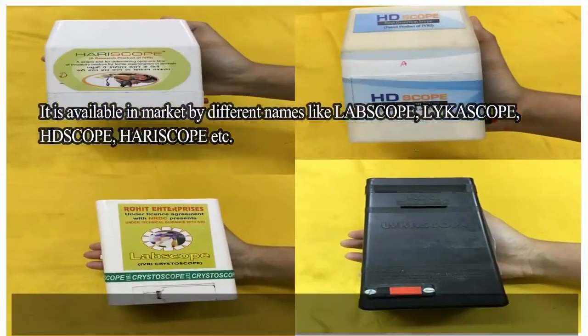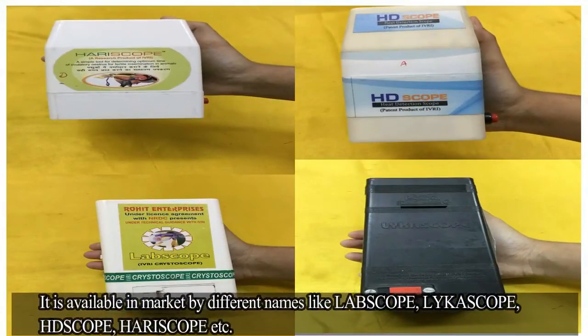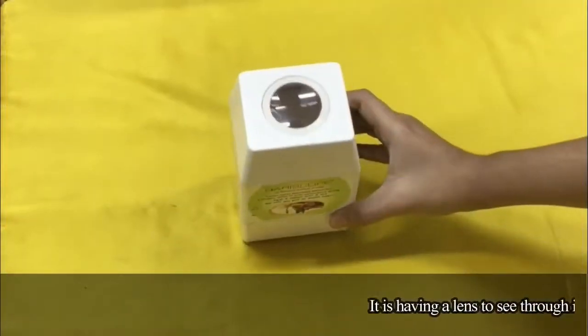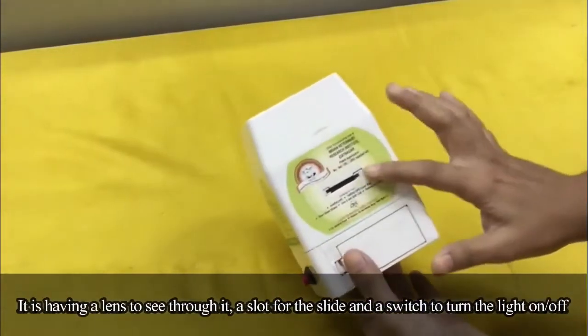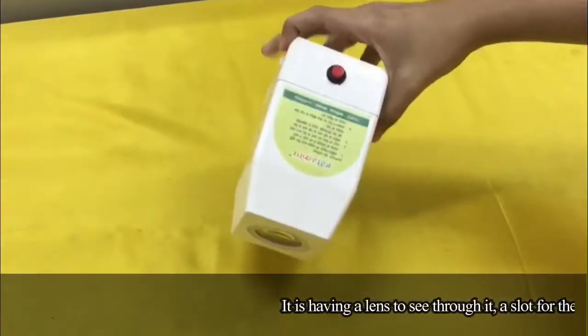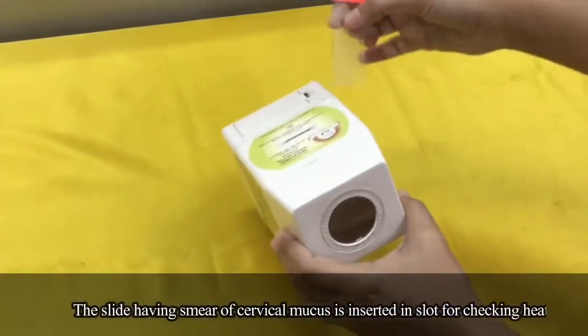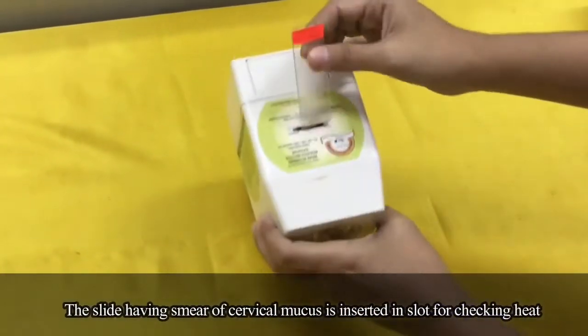The Crystoscope is available in the market by different names like Labscope, Lykascope, HDscope, Hariscope, etc. It has a lens to see through, a slot for the slide, and a switch to turn the light on or off. The slide having a smear of cervical mucus is inserted in the slot for checking heat.